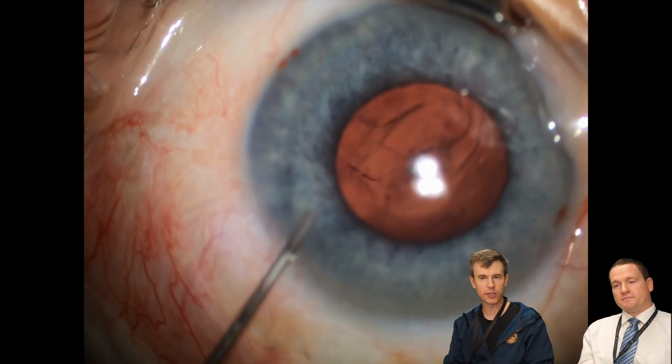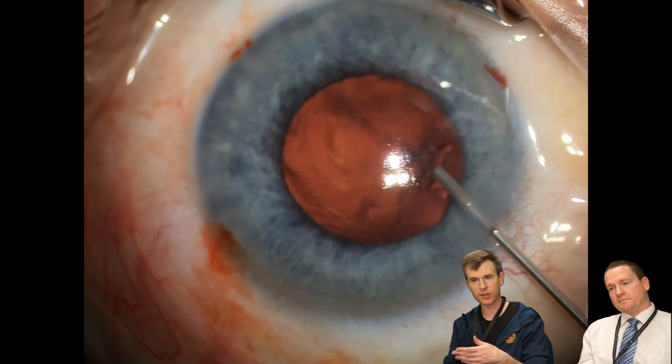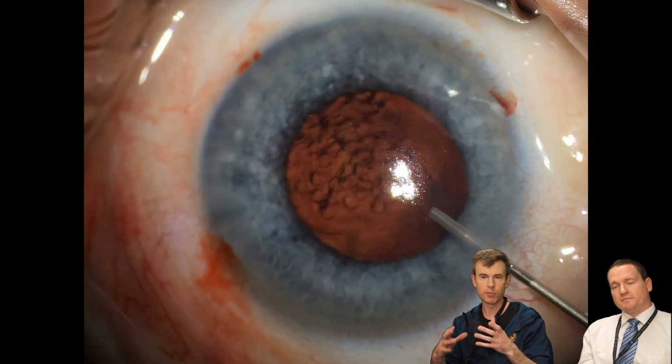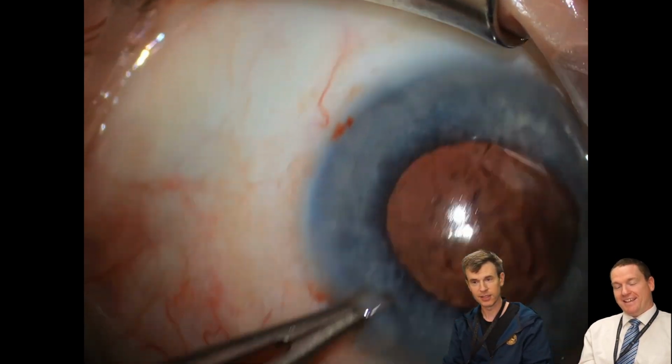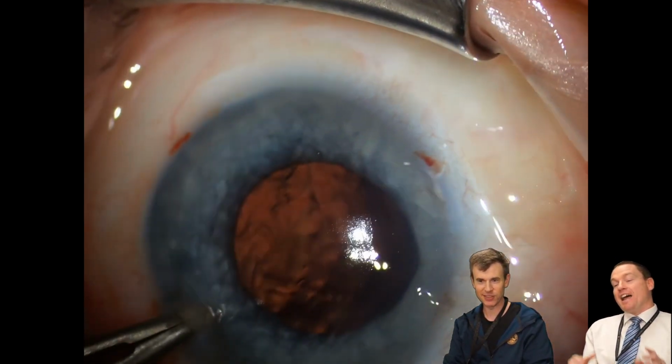And what I do initially is place viscoelastic. After that, I came with epinephrine. Mid-dilated pupil, but makes it a little bit more difficult. Now I'm just looking for the lens. Where is it? Where is the lens? And we're getting the view.